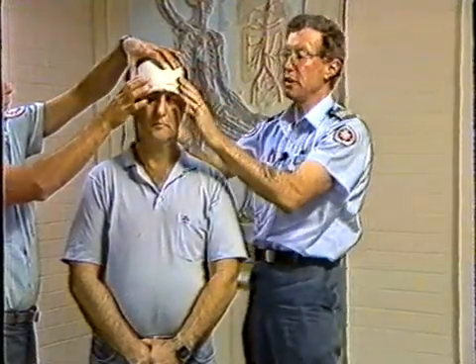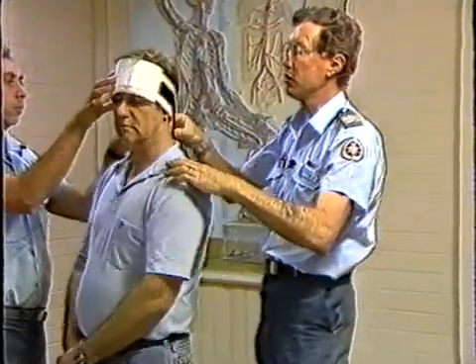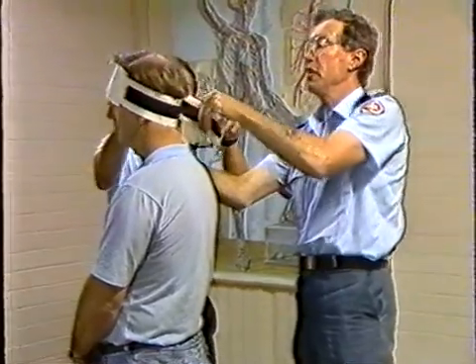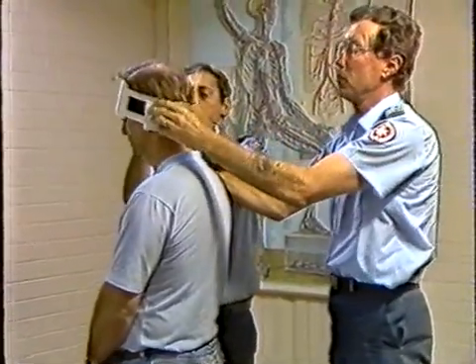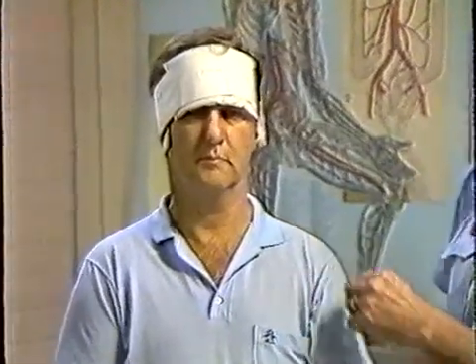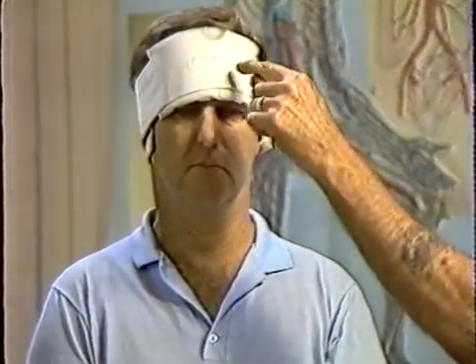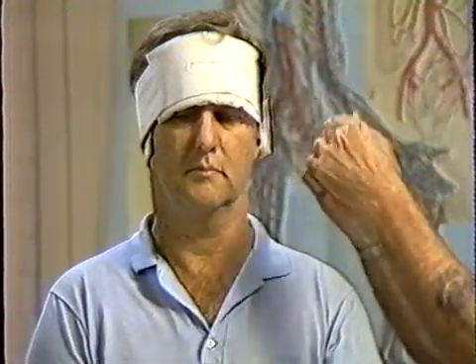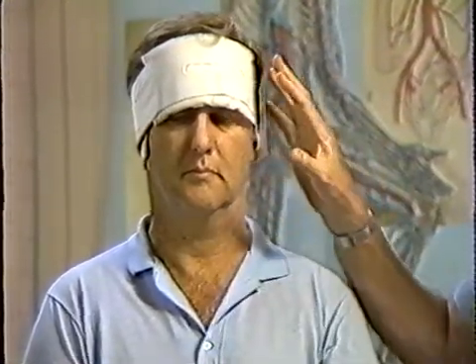Then we take the leading edge, if you like, to turn around to the side end so we can see, under the base of the skull, back over the ear, and then with a little bit of firmness, apply it on. So therefore we have the dressing now held in place. The other bonus is we've got a window into the dressing. If the blood starts perfusing through, we can see it, take it off, put another dressing on top and reapply the Easton bandage.